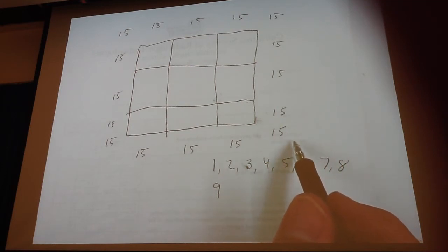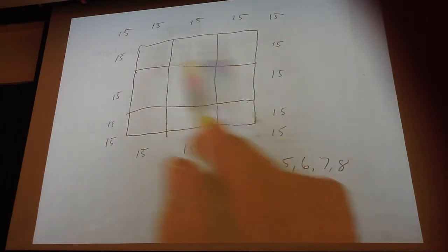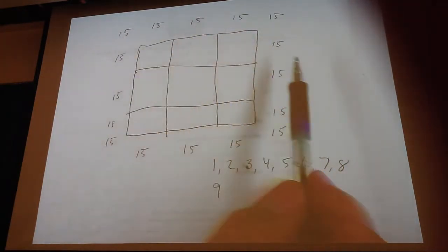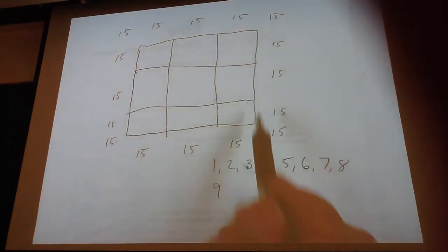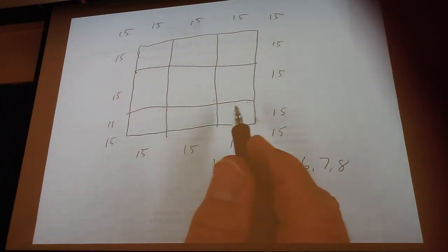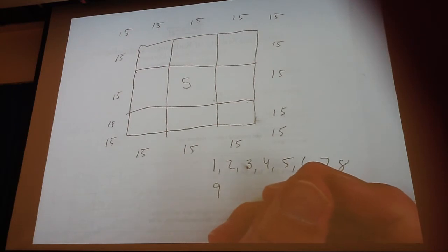So iterative reconstruction technique, this is what the computer is doing. Obviously you're going to have different numbers on the outside here, but you, or the computer, has to guess what those numbers are. I will give you a hint. 5 is in the center here. Does that help?